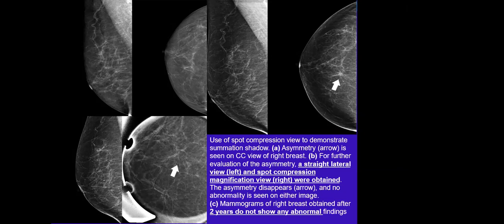But if it is seen far anterior, in the middle or anterior breast, you don't expect it to be excluded in the other view. It has to be within the receptors. This is one criterion: the location of the lesion makes the possibility of exclusion unlikely.